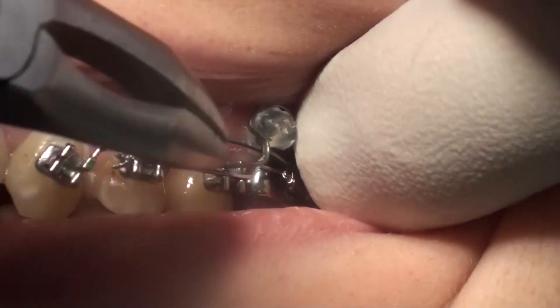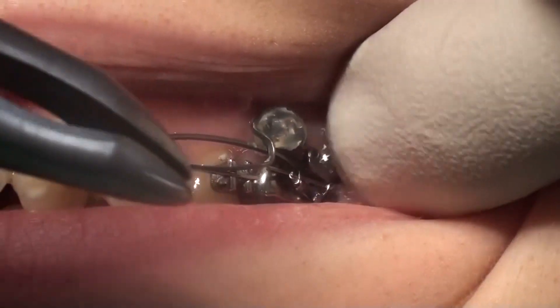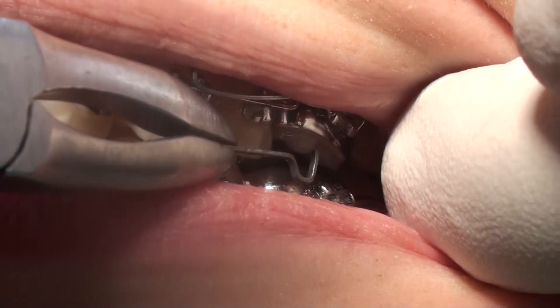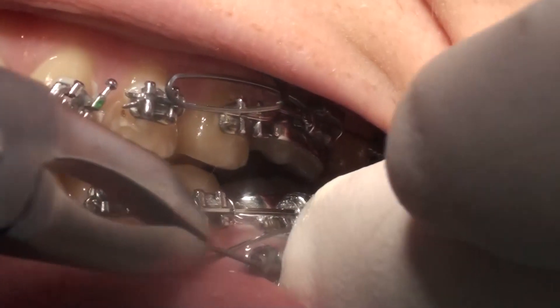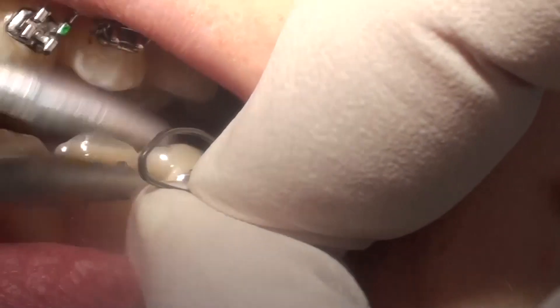Hooking the cantilever around the TAD, this system will deliver a force lasting for many days. Here you see the activation and the wire is again hooked around the TAD.